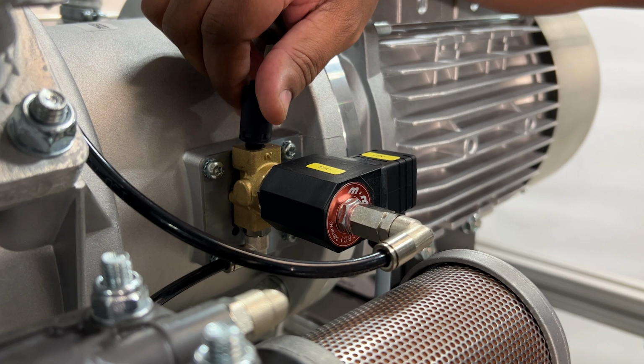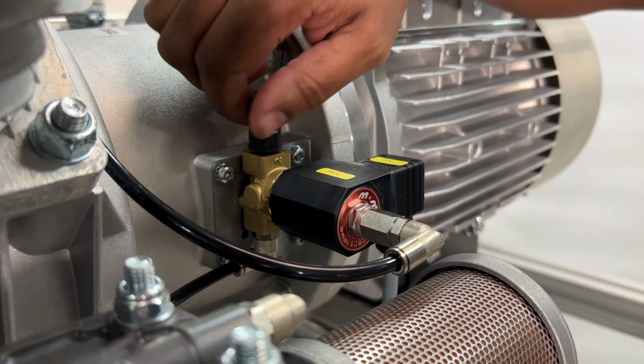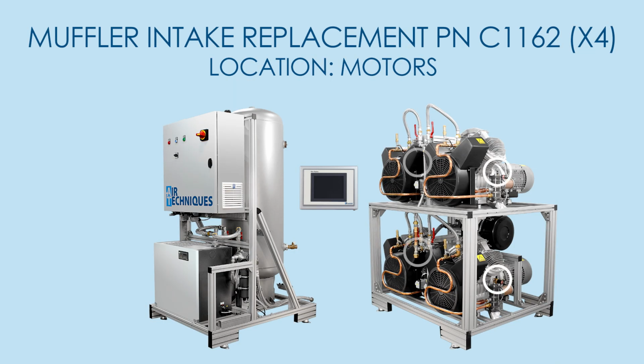Align the new muffler intake correctly, ensuring a proper fit, and securely fasten it in place. Make sure it is tightly attached to prevent any loose connections. Repeat this process for each aggregate that requires a replacement muffler intake.